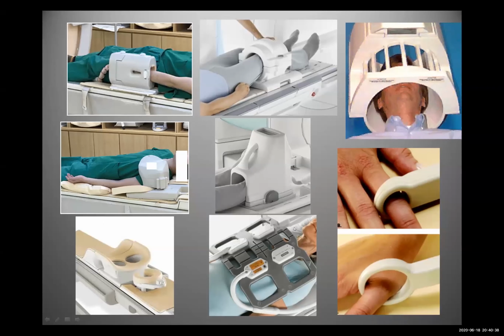The RF coil is an antenna that picks the signal, but again, it has components inside it. If I open that coil, I will see inside that coil circles. Those circles consist of wires, capacitors, resistance. All these are additional sources of noise. So the smaller the coil, as you can see with that one, the better the signal to noise ratio, because there's not too much contribution to the noise. The resistance of that coil is very minimal, and accordingly the noise will be less.